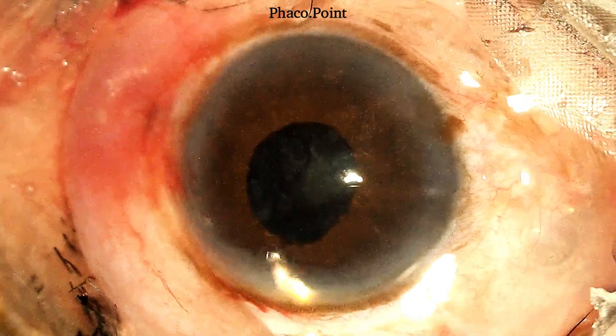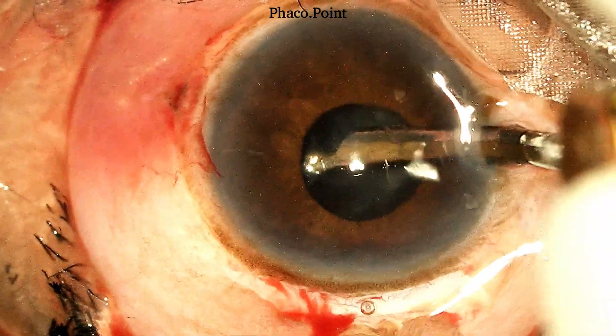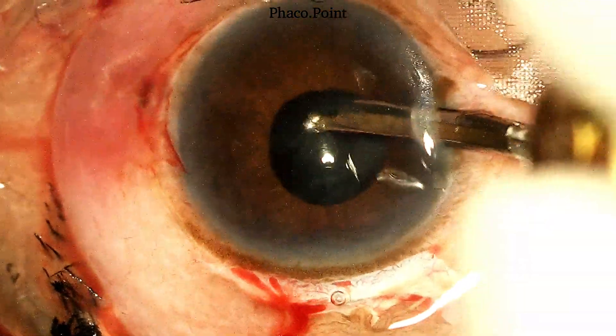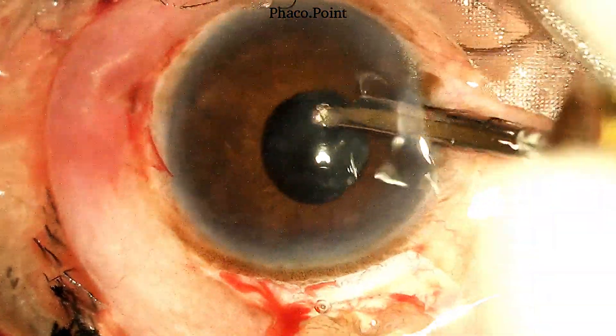At all times, you need to make sure that you have good illumination, a fairly high magnification, and a perfect focus. It is equally important that at all times you ensure that you do not damage the pupil by accidentally holding it.